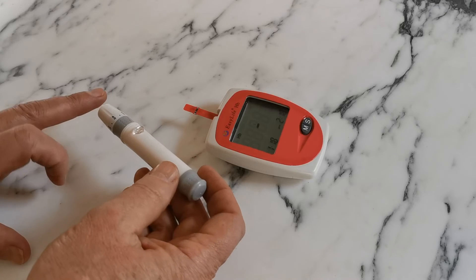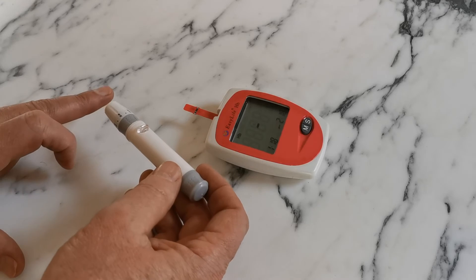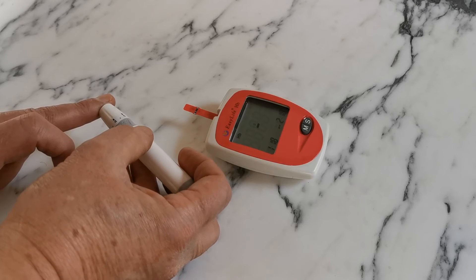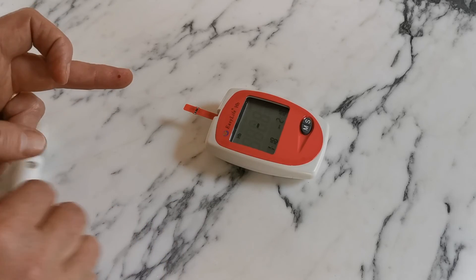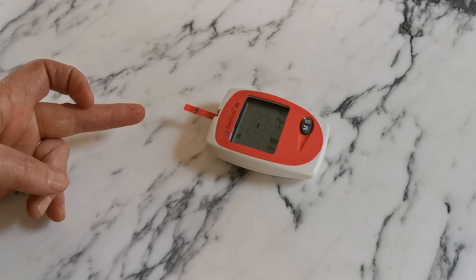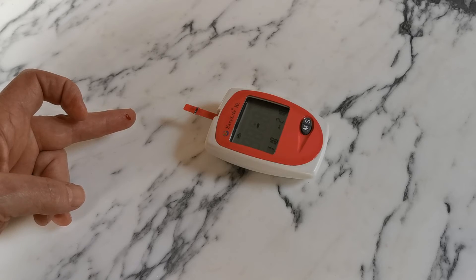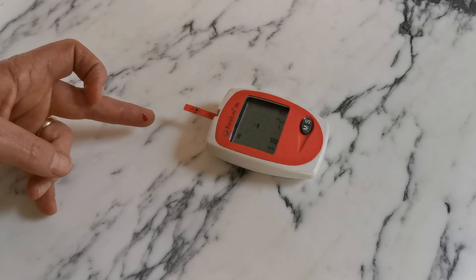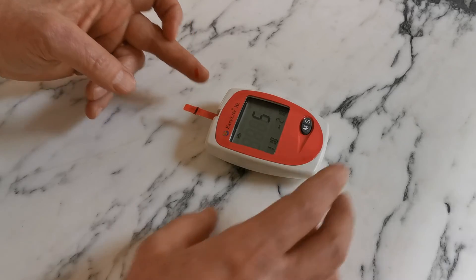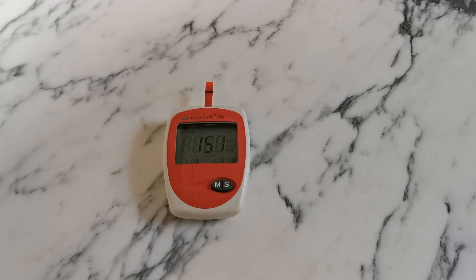When ready to test, always lance on the side of the finger at the distal phalanx — never the flat pulp, as this tends to be quite fibrous. Place the lancing device firmly against the side of the finger and release the trigger. This should result in a blood droplet forming. Wipe the first droplet away using a tissue and allow the second droplet to form naturally. If this does not occur, you have not lanced deeply enough. Do not squeeze the finger, as this will result in an inaccurate reading. Place the sample onto the side of the test strip and capillary action will pull the sample into the device.